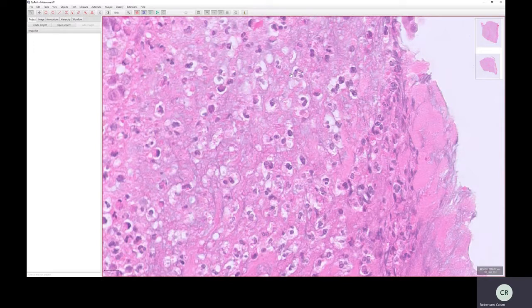And it's got 3 lobes. Remember, this is a 2D section through a 3D structure. You might not always get all 3 in the plane of section, so you might just see 2. But here's a cell with the 3 lobes, 1, 2, 3, and actually this has the Mickey Mouse look. It's like Mickey's face with the 2 ears, and then it's got a little bit of pink cytoplasm round about it. Here's another neutrophil, but it's difficult to appreciate the 3 lobes. This is 1, this is 2. That could be the third, who knows?